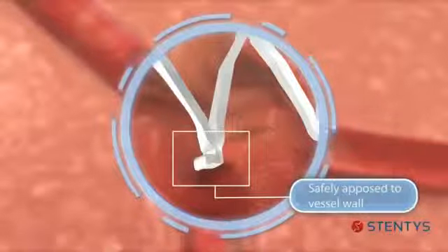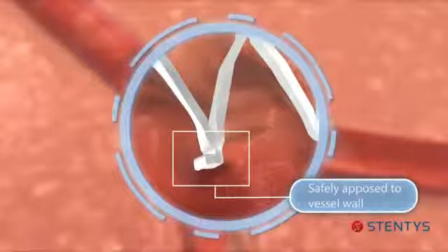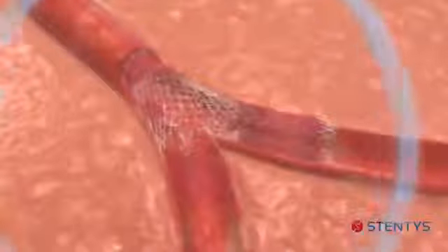The shape memory properties of nitinol make the disconnected ends return to their initial position and safely appose to the vessel wall.